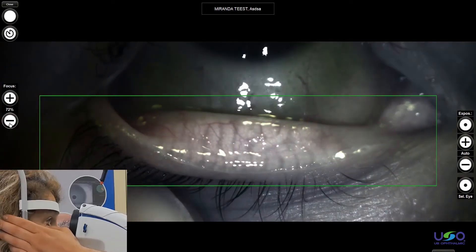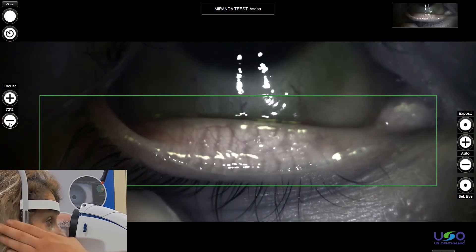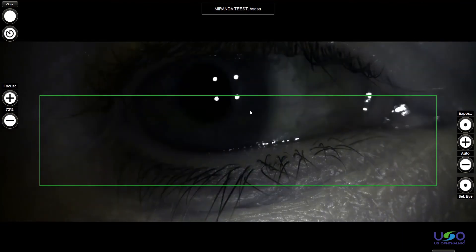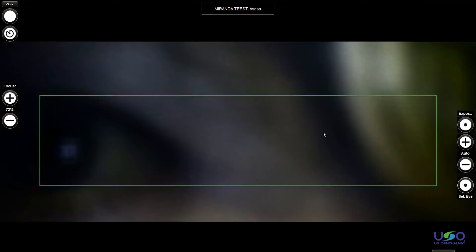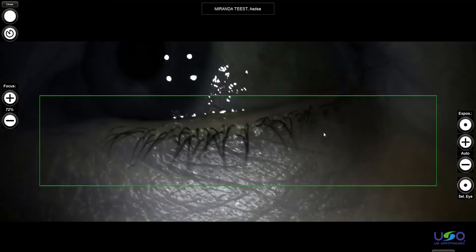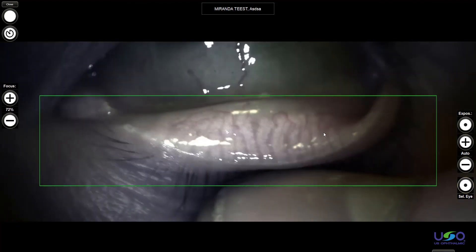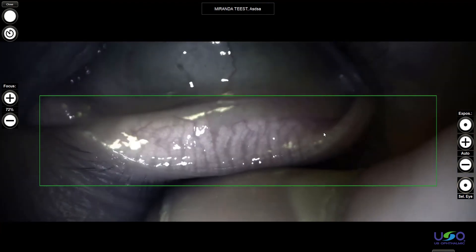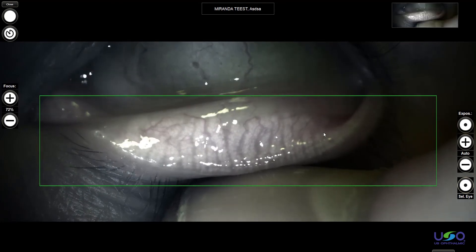Here you can see the entire gland system. Then you can take a picture with the footswitch. Once the picture is taken, if you want, we can select the eye. We can do the other one as well, going to the other eye. Let's do the meibography for both, because it's an interesting case. I push out the lid and then take a picture. This picture is very nice.